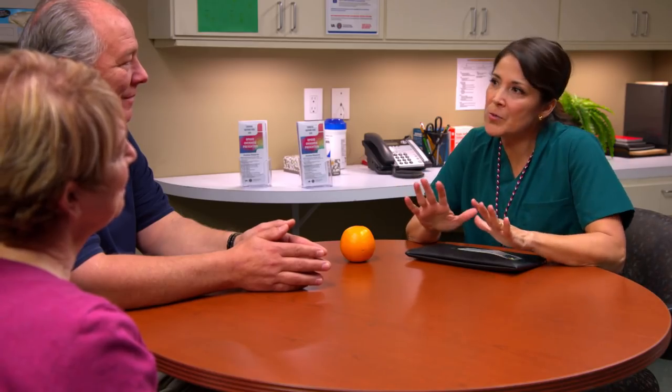It even has this attractive carrying case suitable for casual or formal occasions. The real one doesn't say demonstration kit, I'm guessing? Right, the real one does not say demonstration kit on it. One thing you need to remember: be sure not to store the kit for prolonged periods in heat, direct sunlight, or extreme cold. You want to try to keep it at room temperature, otherwise the drug doesn't work as well.